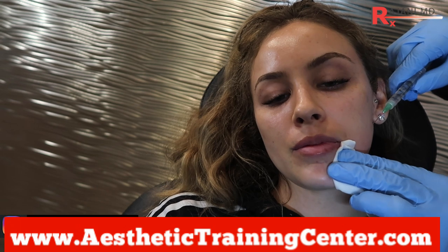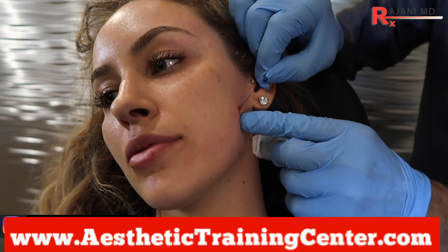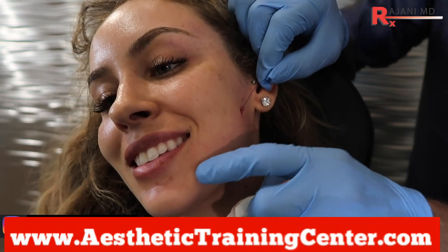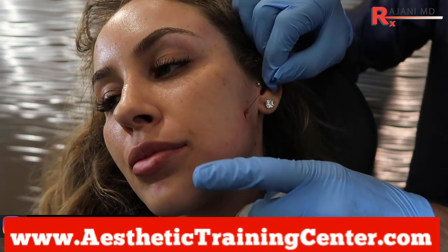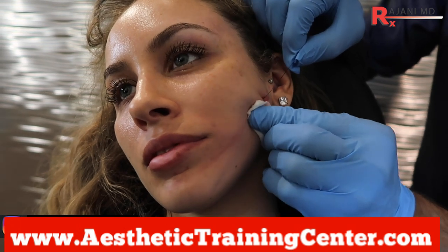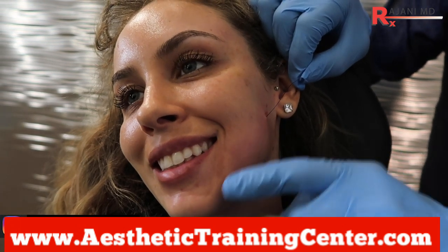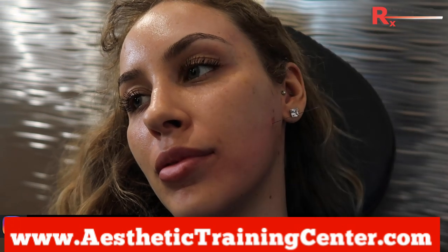Push through — that's far enough. We can get a little more towards the midline and that's pretty good. How are you doing? Good. I'm going to put a little pressure here — I do a right and left little twist. You can see the thread in there. I'm going to pull out and here's our thread. We're pushing and pulling on the thread. I'll get her to smile — no irregularity. If there was, I can unzip it.